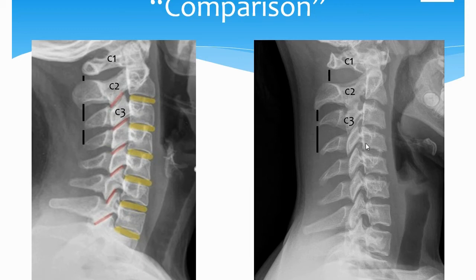And this misalignment would not be a very good structure for a disc to stay healthy. Again, the X-ray does not show the discs, and even though it's being highlighted here, this is just the estimated disc space. The disc could be protruded at any side right here, which X-ray is not detecting, because this X-ray does not show the discs, but it shows the bones. But we are assuming the disc right here would have a shape as such.